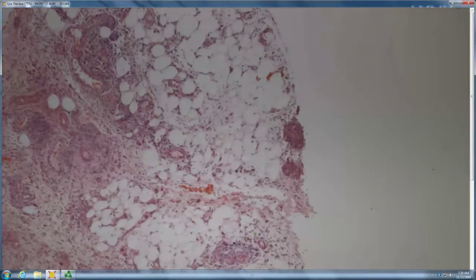So I'm thinking more there's a lot of granuloma, which suggests we're in a chronic stage, and yet at that chronic stage I don't see a lot of fat necrosis. Okay, right? So I'd put it more in a septal granulomatous panniculitis, which goes with erythema nodosum. Give me some causes for erythema nodosum. Strep, oral contraceptive pills, and the pill's probably overrated as a cause, but strep, definitely.